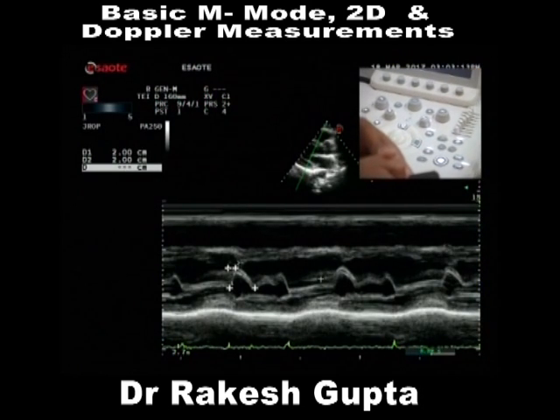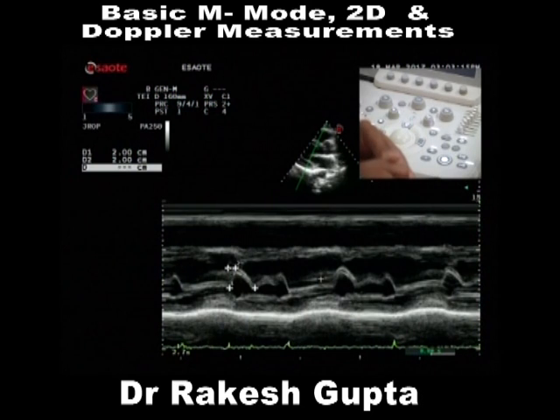D point, this is E point, this is E point, this is F. So EF slope, DE excursion. Although this is not the right value, this system has to be opened up. Once we go to the hands-on, then we can utilize other systems.